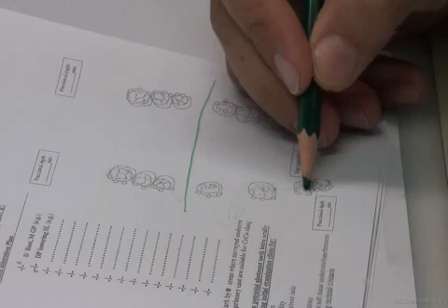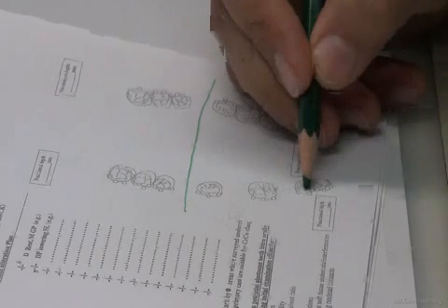So I would have double rests. Single rest here and an occlusal rest here. But of course the 4 has another adjustment. Lower 4. This is specific to the lower 4. Can the technician here see the type of the 4? Lower 4? Do you remember the developmental variations between 4s? There are lower 4s with complete lingual cusp. What is the type of rest I do there?